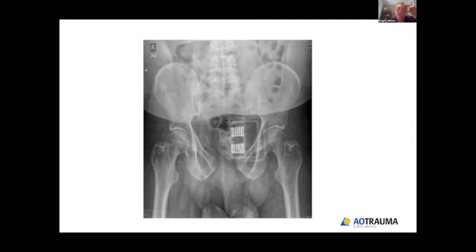So this is the patient after he's in a binder. So you can take a second there. You can see the binder artifact on the x-ray. And we can see the patient's closed down quite a bit. So at this stage, you've got to think, if this patient has not been fully resuscitated, if they haven't responded, what would be some options to manage that? So probably the binder could be retightened and improve the reduction.